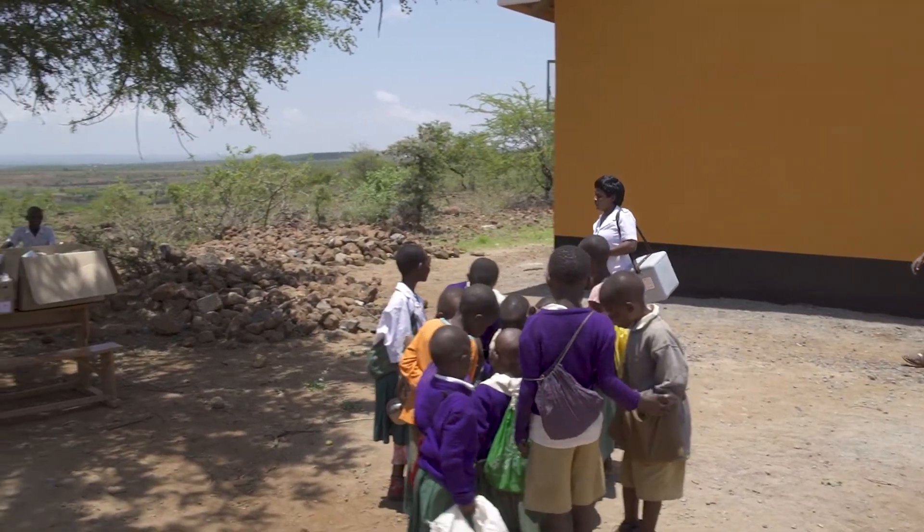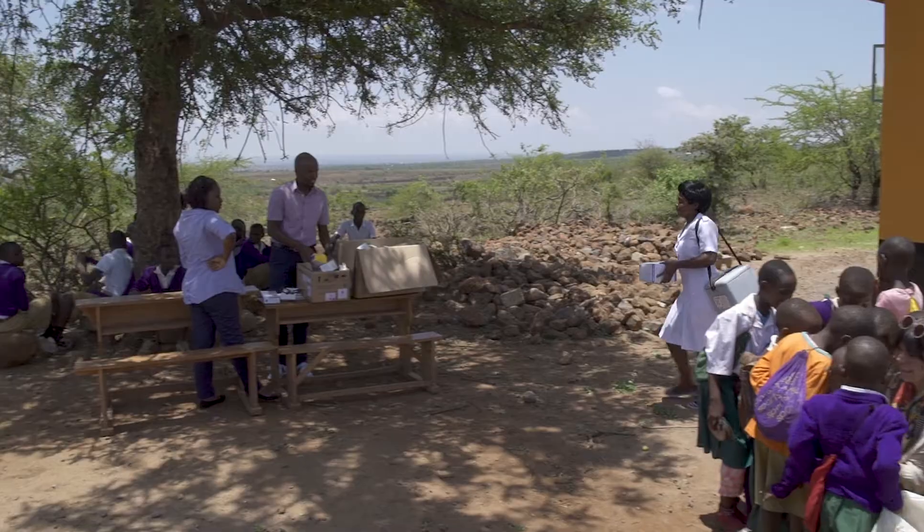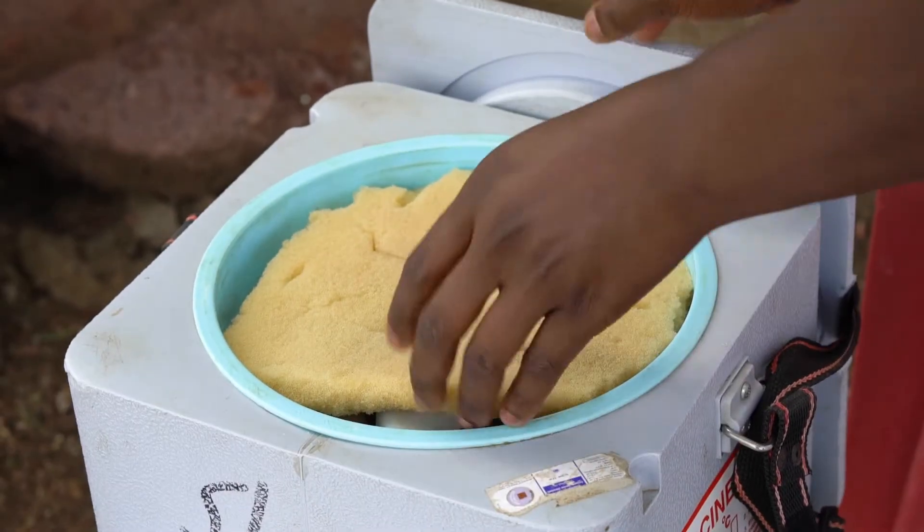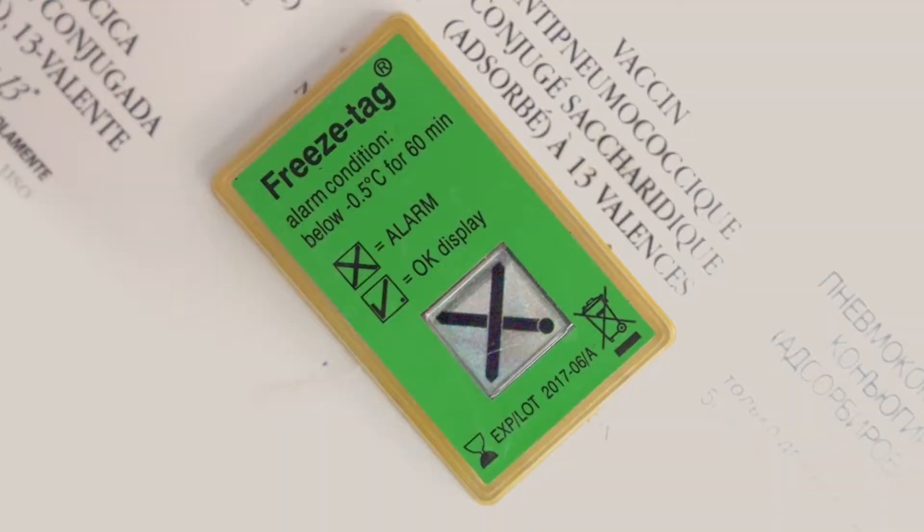You just arrived at an outreach session where you will be administering Hep B, a freeze-sensitive vaccine. You open your vaccine carrier to find this reading on your freeze indicator. Would you feel confident giving children these vaccines?